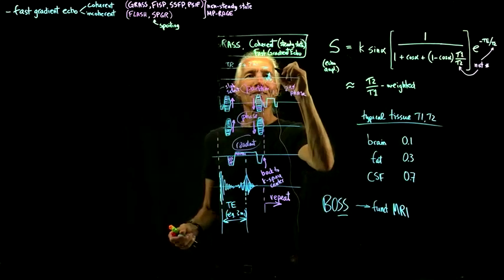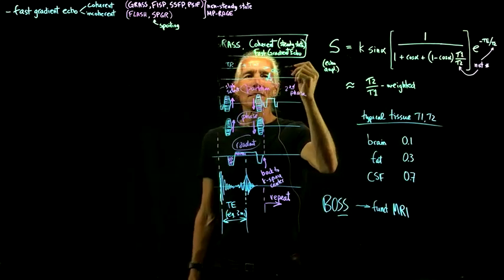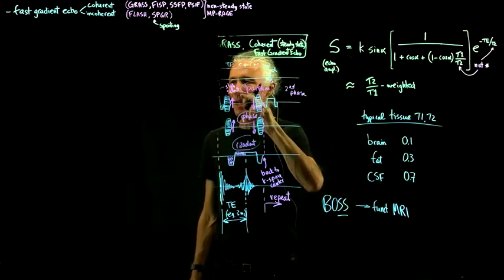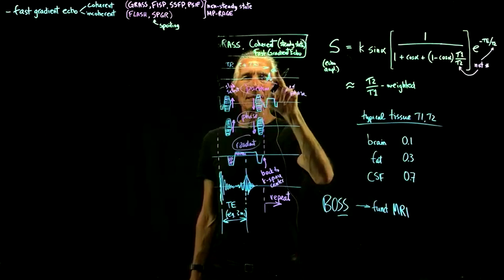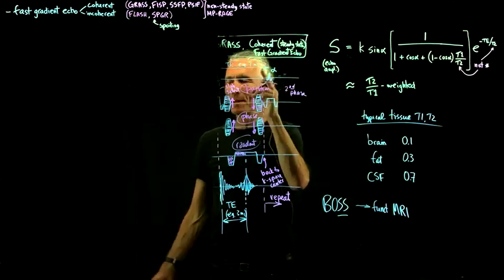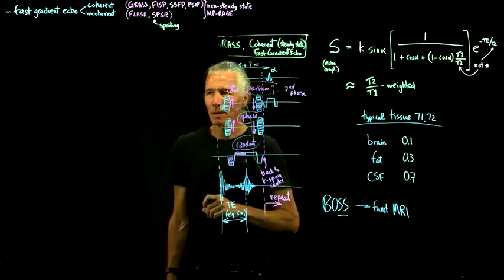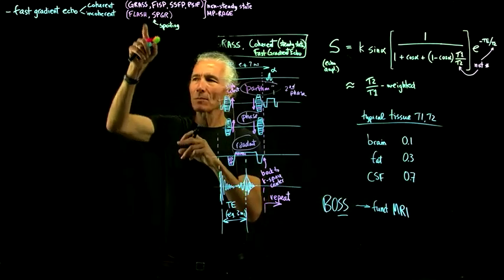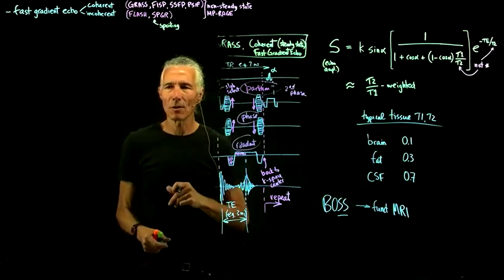Yeah, so this alpha, in this kind of sequence, it can be higher. A lot of times it would still be relatively short to avoid getting too much RF, because you're doing so many zillions of them. It might be like 30 degrees. But in the next one that we're going to talk about, the spoil grass is typically much smaller, like 7 degrees, very low.